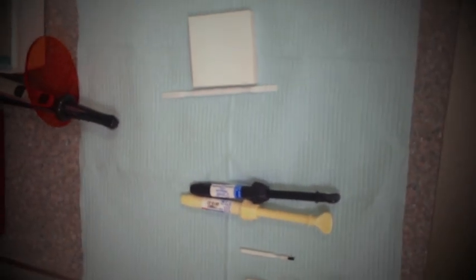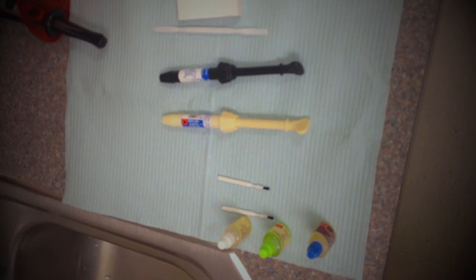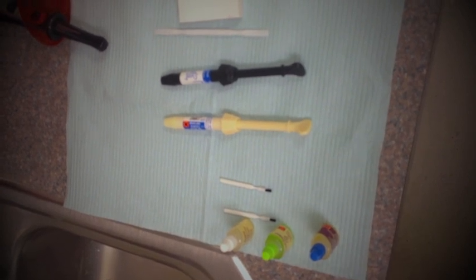Alright, so here is the setup. This is the cement that we're going to mix. We're eventually going to mix those. We have our pad here, we have our spatula. You have the etched bulk of the lingual of the teeth that the bands are going to go on.